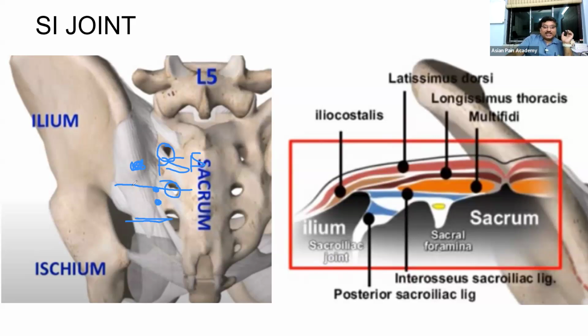So our target is at this point, to look at the surface anatomy. If we put the probe like this, for example, at the posterior superior iliac spine, in that case, what will we see? Remember, the PSIS usually falls between the S1 and S2 foramen.